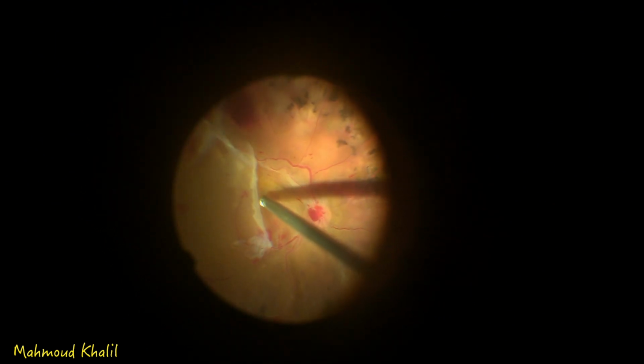Catching the forceps and removing the membrane from over the disc. If there are bleeding points from the disc, then elevation of the IOP is almost enough to control these bleeding points. When cutting between the bridges, the membranes are isolated into small islands. This can be done repeatedly in different parts.